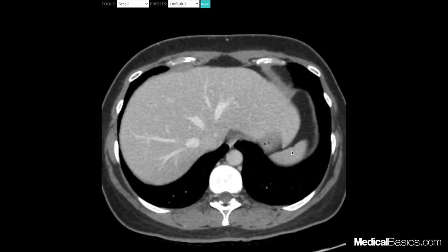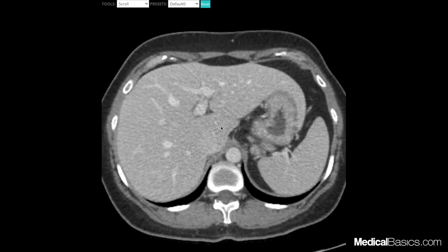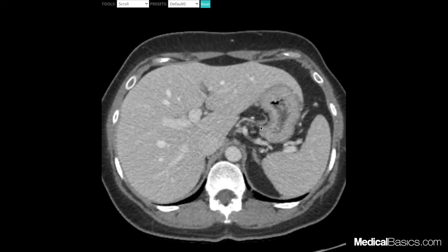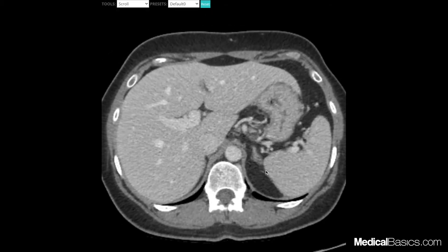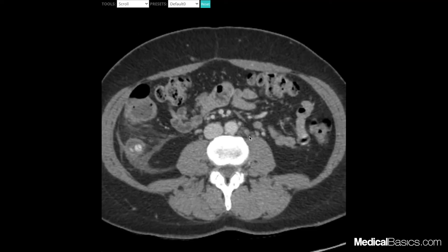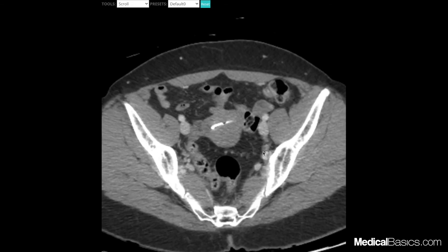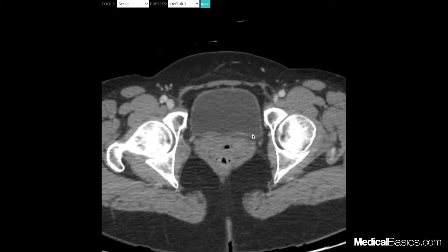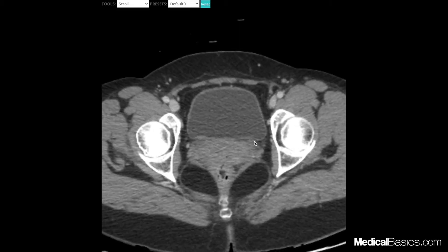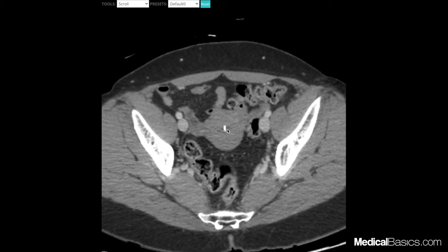This is going to be the spleen. If you're trying to determine whether someone has splenomegaly or hepatomegaly, that's going to be much easier to measure on a coronal view. Here are our kidneys, and here is our ureter — you can follow it all the way down with the mouse cursor tracking the ureter slowly down until it dumps into our bladder. This is our ureterovesical junction right here, and this is going to be our bladder.